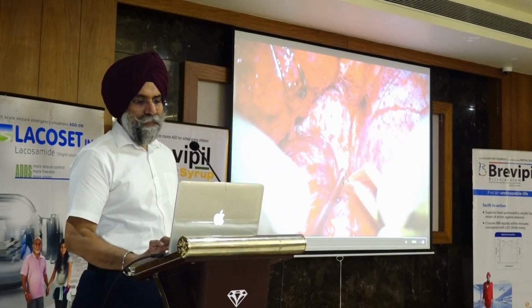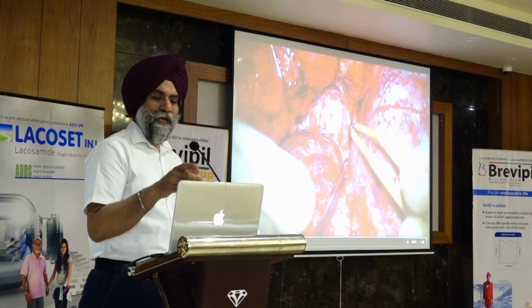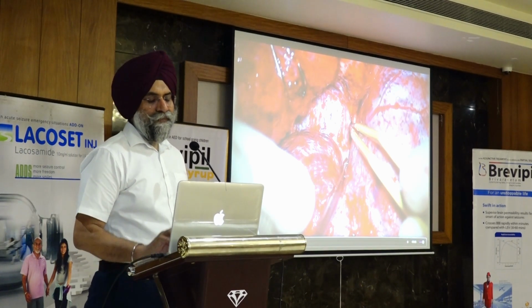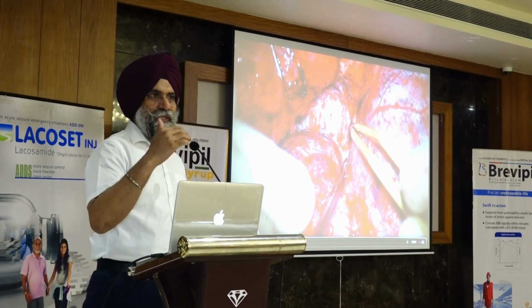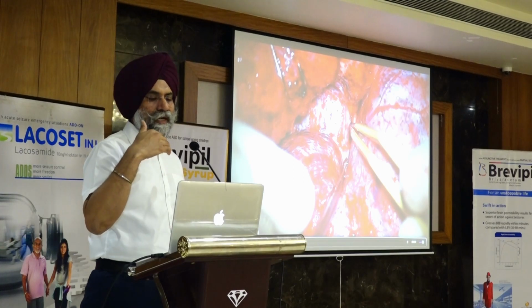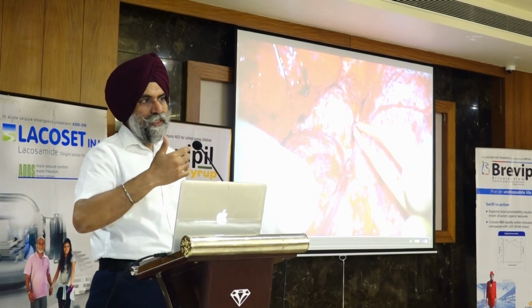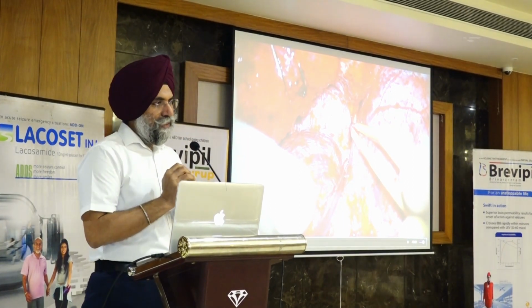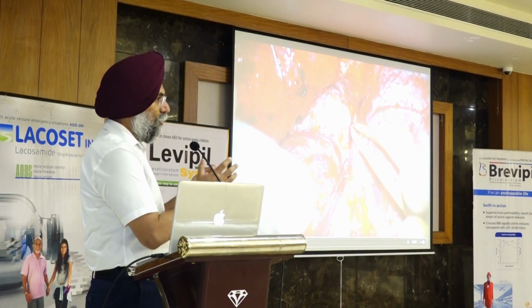Now you have to develop the plane between the rootlets of the nerve fibers of V1 here. So you can just longitudinally dissect from here and enter into the cavernous sinus. And many times with the benign tumors, be it a schwannoma or a cavernous sinus meningioma, in both of these conditions the internal carotid artery is pushed anteriorly and inferiorly. It is never posteriorly. In cases of pituitary adenoma, it is encircled, and many times in cases of the meningiomas also, it is encircled all around.